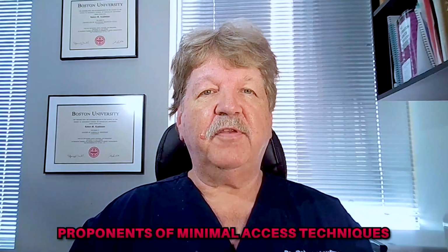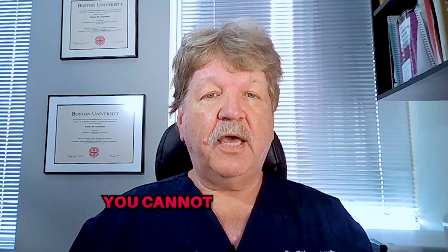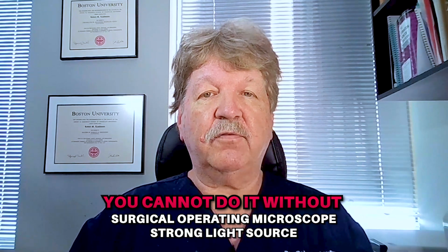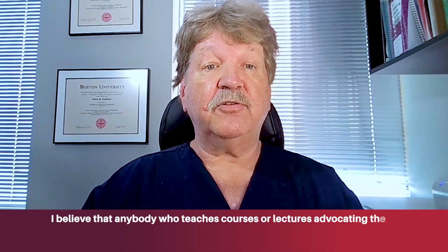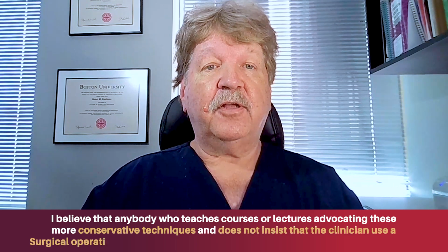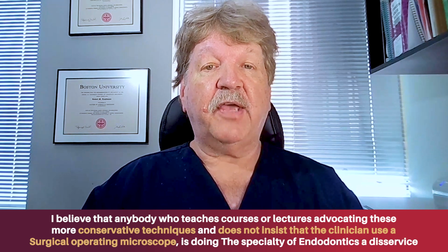However, proponents of this minimal access technique fail to mention one very important point when discussing this: the need for adequate magnification and illumination. If you're going to try to make these ultra-conservative accesses, you cannot do it without a surgical operating microscope and strong light source. Loupes are not enough. I believe that anybody who teaches courses or gives lectures advocating these more conservative techniques and does not insist that the clinician use a surgical operating microscope is doing the specialty of endodontics a disservice.